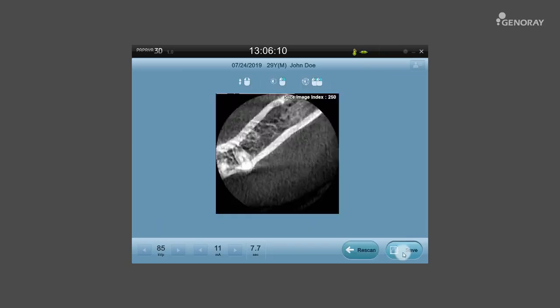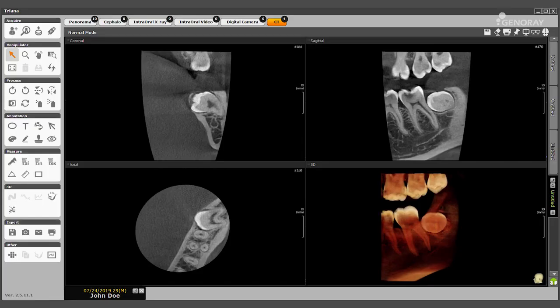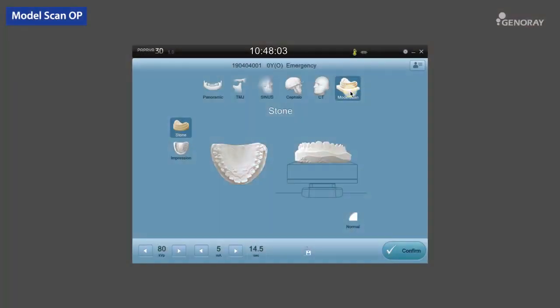When the scan is complete, select the Save button and then use Triana to review the images. Next is the Model Scan Exposure mode. It is possible to extract STL data through scanning a stone model or impression.